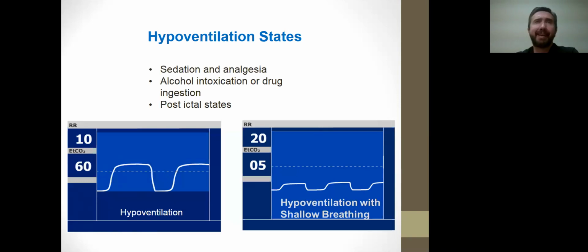Other reasons CO2 may be high are increased cardiac output with increased breathing, fever, sepsis, pain, severe difficulty breathing, depressed respiration, or even chronic hypercapnia. Some diseases may cause the CO2 to go down, then up, then down, then up, such as what we would see in a patient with asthma. Okay.